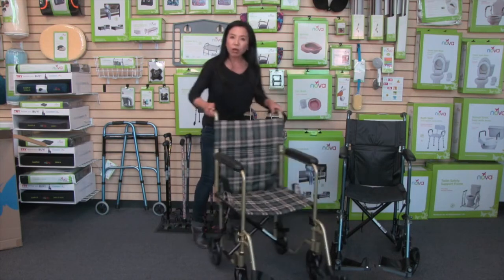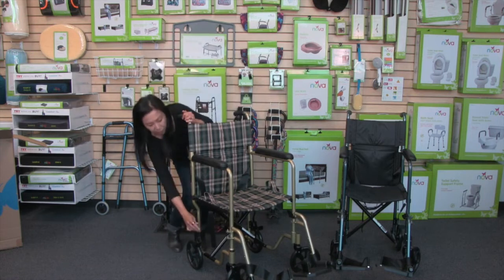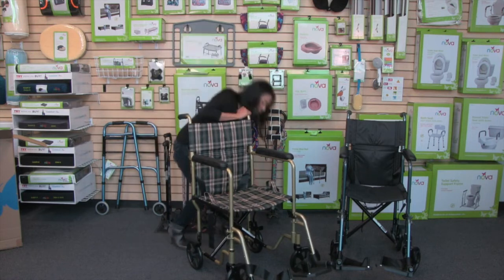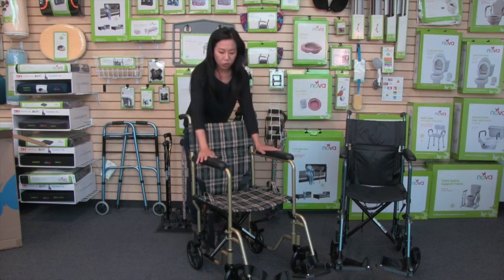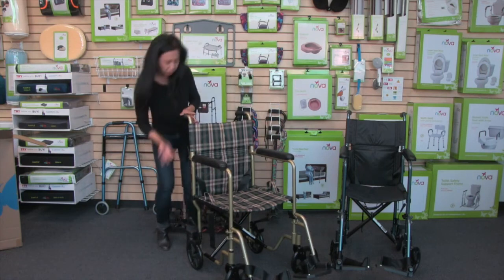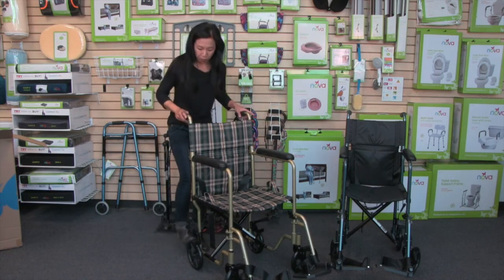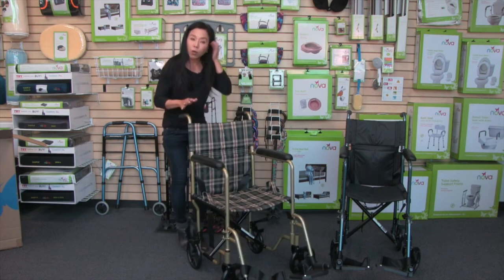The transport chair has nice rugged eight-inch wheels, and the back wheels lock — we have these lock brakes here. It's important to lock the transport chair when the user is getting in and out to make sure the chair is stable. To release the brakes, just pull up on the handles. We also have curb pedals in the back, making it easy to get the transport chair over a small curb or a bump.